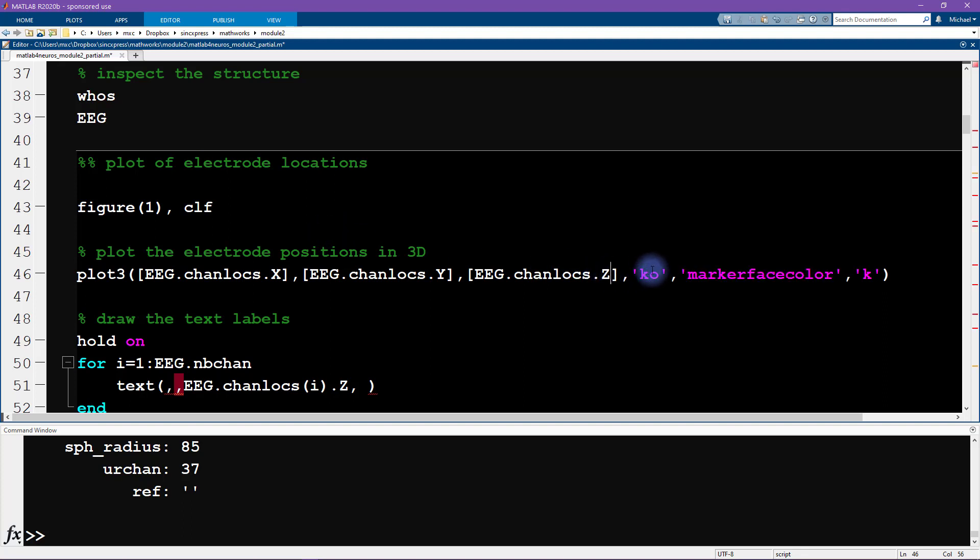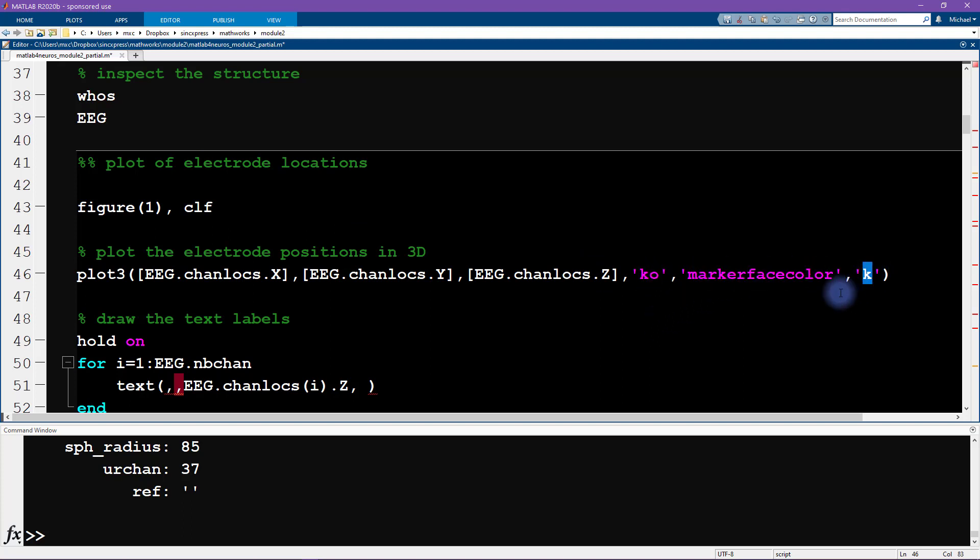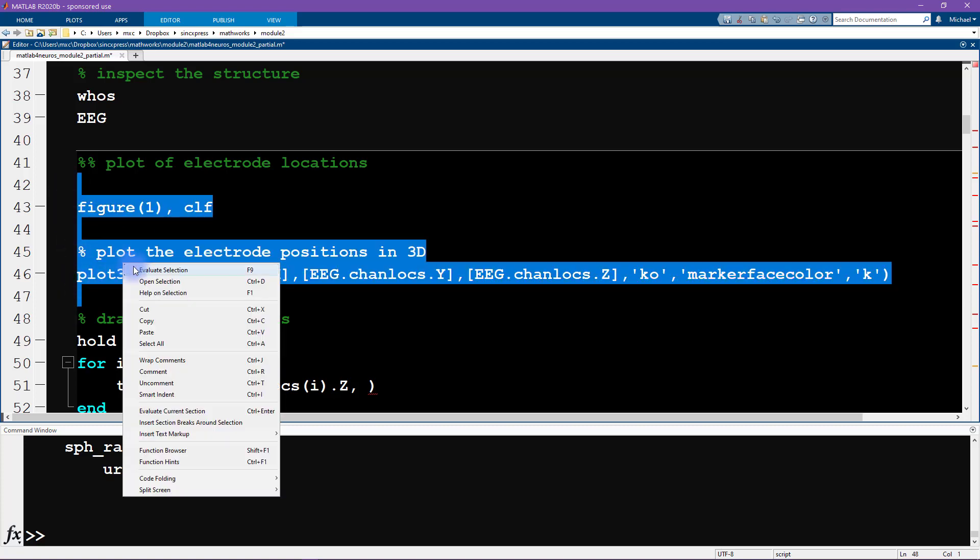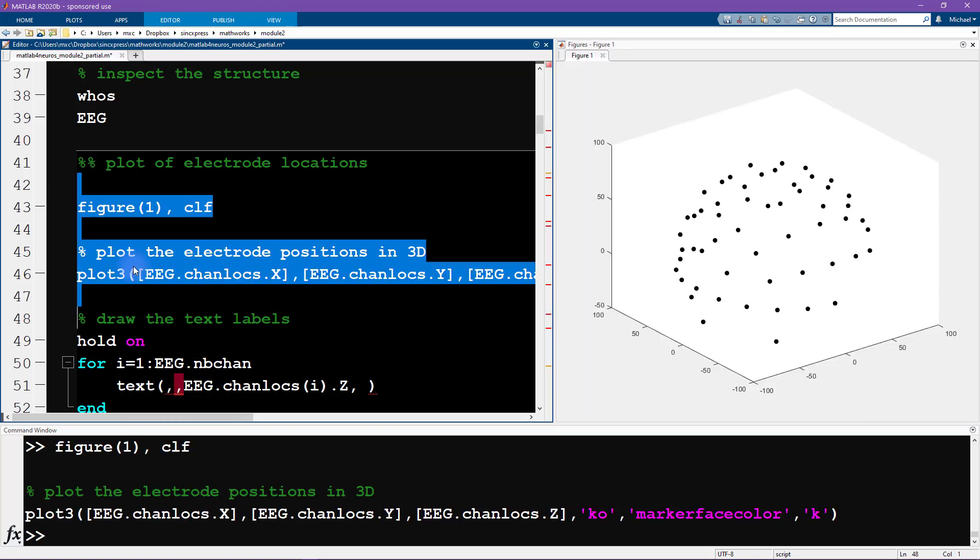This indicates that we are going to be plotting with a black circle and the marker face color will also be black. I encourage you to explore and try different options for coloring and marker type and so on. I'm just going to make this plot as is. Pretty good. We're off to a good start. Here we see the locations of all the electrodes. It looks a little bit similar to what I showed in the slides.